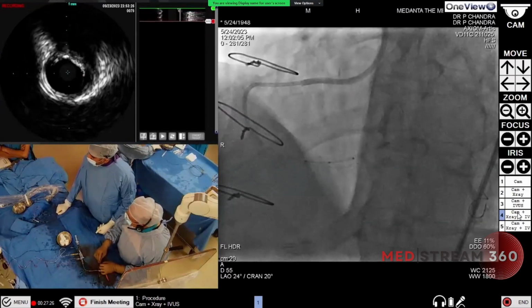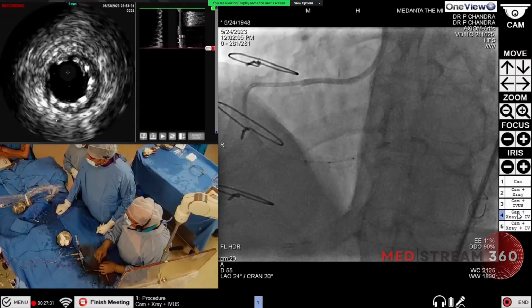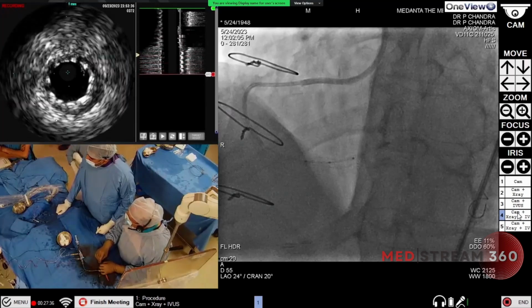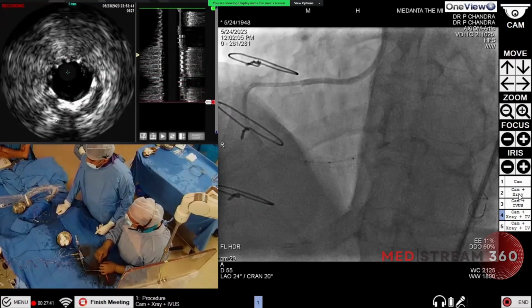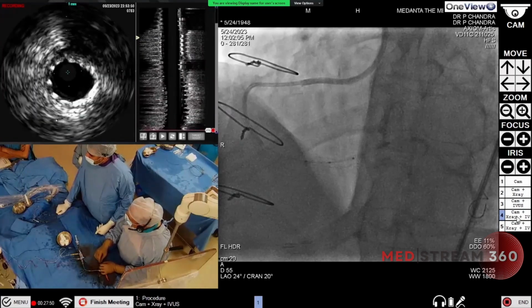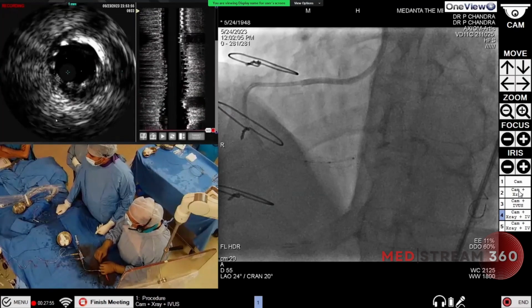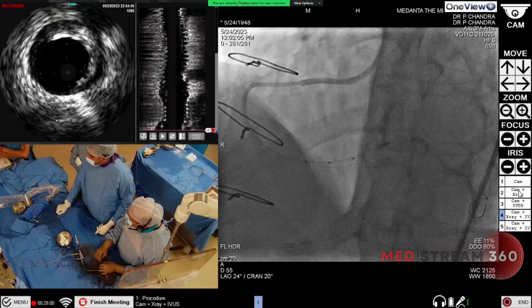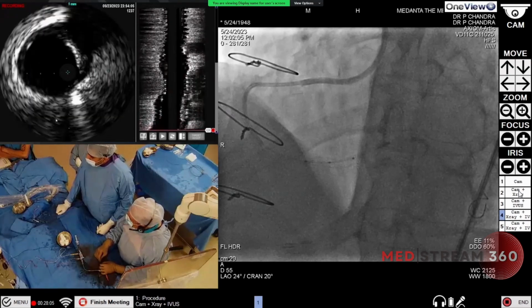Distally, we are fine. As you can see, there are some distal calcific spots, but this is fine. I think it is okay. You can see that distally the stent is well expanded, and we come into the mid segment. Here also the lumen looks good. Okay. And also at the bifurcation. Here we have to do with the 4, I think. Yeah, stop.